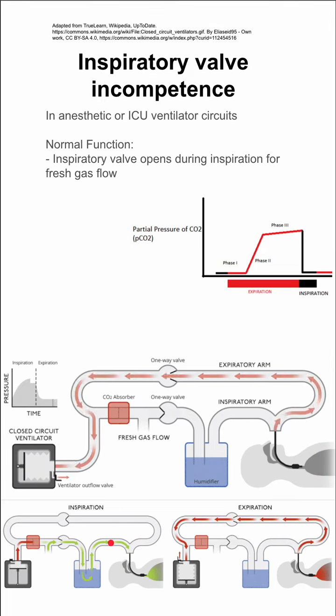In these diagrams down here, the proper flow of gas is always in the counterclockwise direction. So during inspiration, this green arrow flow should be counterclockwise going in this direction. So your inspiratory valve, which will be around here, should be open during inspiration.